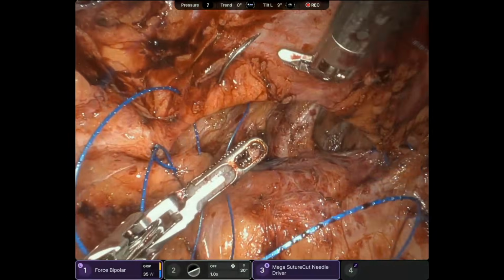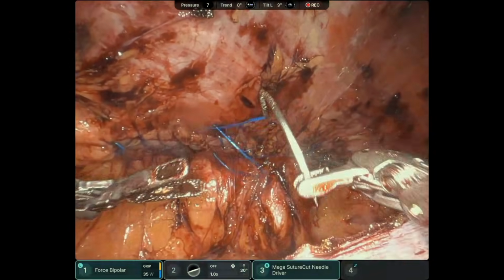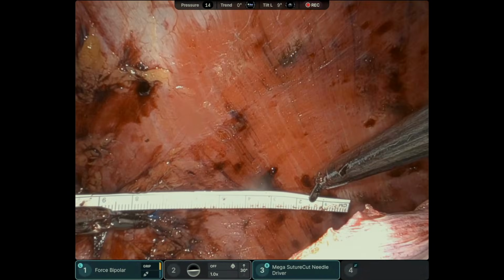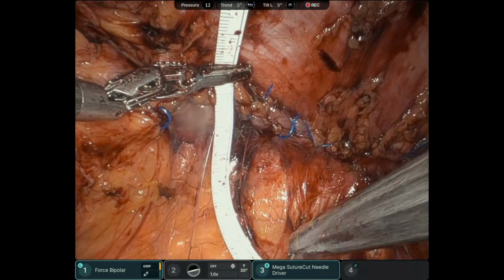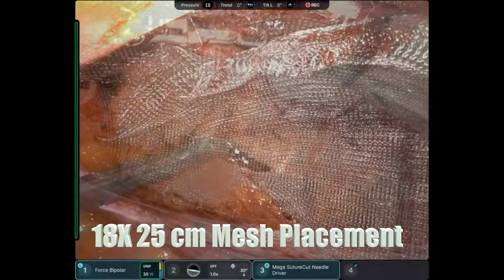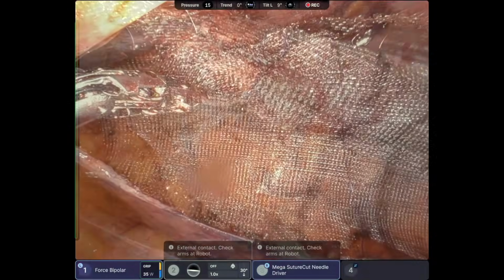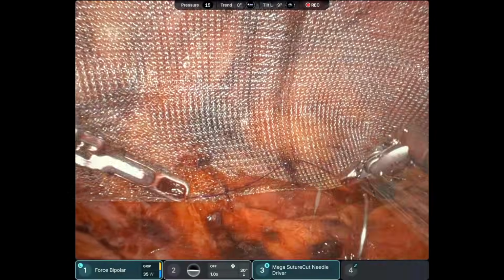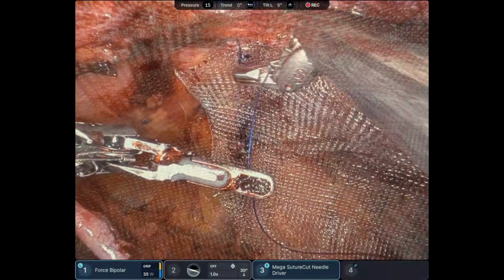I start going top down, then I'm going bottoms up. We meet in the middle. The defect is closed. The muscles are back, associating with the iliac crest, back to where they should be, allowing these muscles to hopefully fire appropriately and maximally in the postoperative period. I utilize a heavyweight mesh here that's going to contour over psoas. I utilize PDS cardinal suture to ensure that the mesh looks flat.